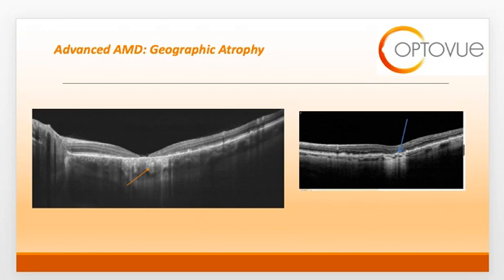The advanced stages of AMD include geographic atrophy and choroidal neovascular membrane. With geographic atrophy, you can see well-defined areas of hypopigmentation of the RPE with loss of the outer nuclear layer, photoreceptors, and RPE in the area of geographic atrophy. This results in overall thinning of the neurosensory retina and loss of the choriocapillaris. Due to the increased signal below the RPE, you will see a hypertransmission defect in the choroid. The blue arrow points to the area of geographic atrophy with underlying hypertransmission defect, and the orange arrow shows the increased visibility of the choroid due to loss of the overlying RPE and neurosensory retina.